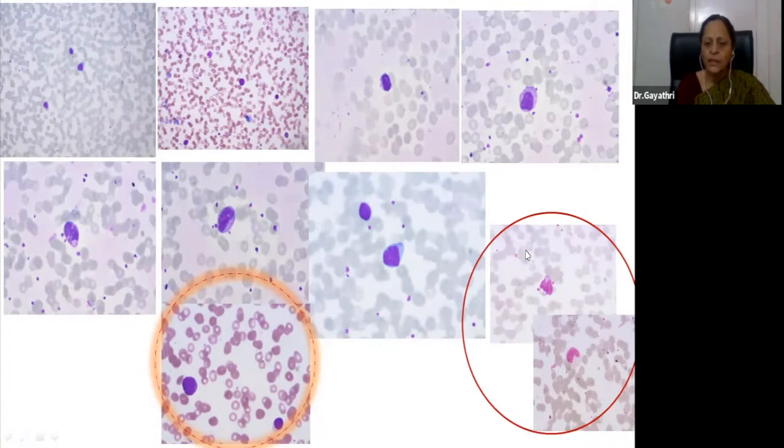And then what you see, the other agranulocyte in the peripheral smear, is the monocyte. These two are images of a typical monocyte. This one shows vacuoles in the cytoplasm. This one shows you the lobulated nucleus of a monocyte. What you must know is that all these are within the normal. Being familiar with the normal variations in morphology helps you to not make an erroneous diagnosis of very ominous conditions like acute leukemia.